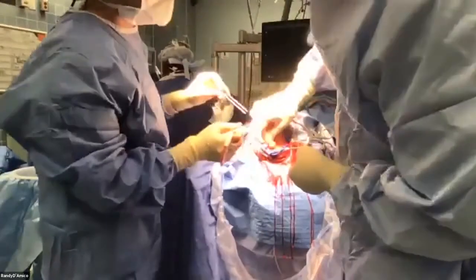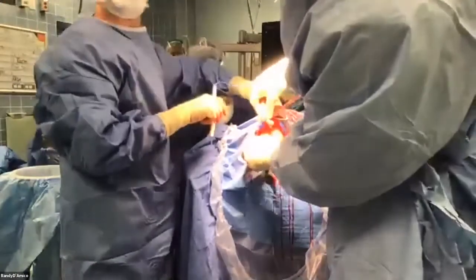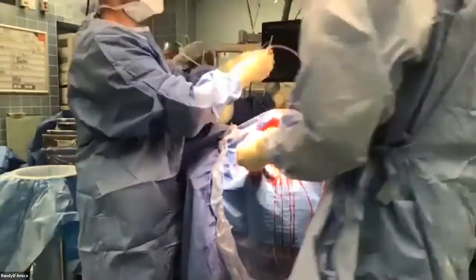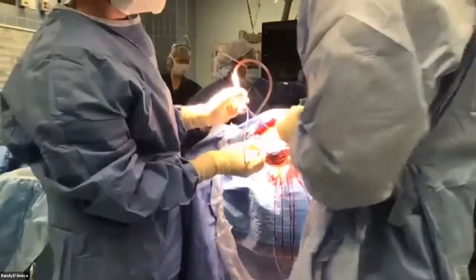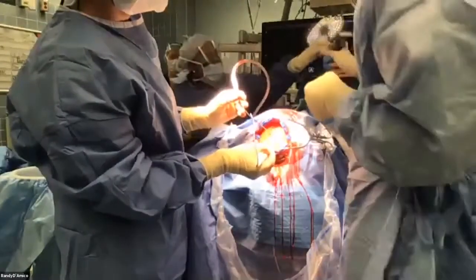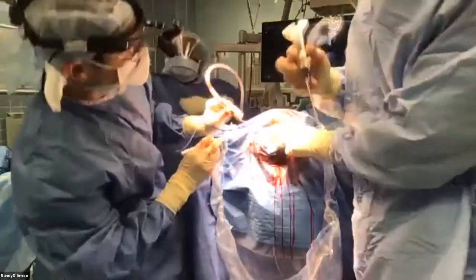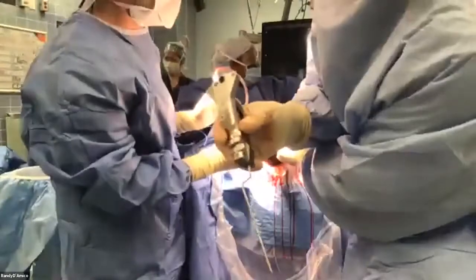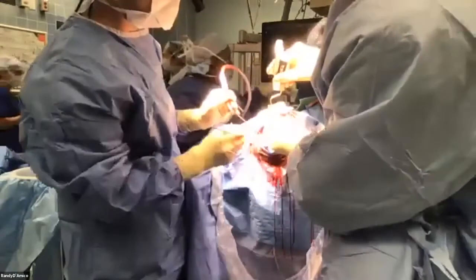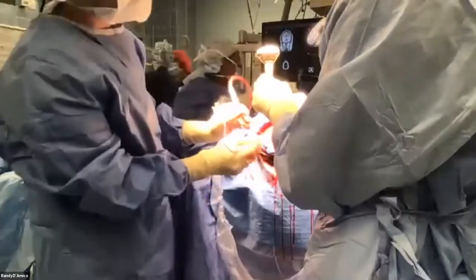All right, so that's skull, and right here, I don't know if you guys can appreciate it or not, but there's a bony abnormality. So our tumor is right there. You see the wand? Dry sponge and a marking pen. So this is neuronavigation. Based on its preoperative MRI, with millimeter accuracy, we're able to identify exactly where the tumor is. We register that based on the scalp. So what you see here is the tumor on the screen.